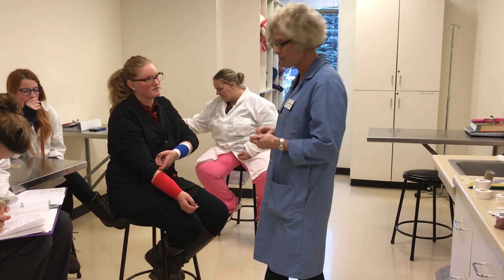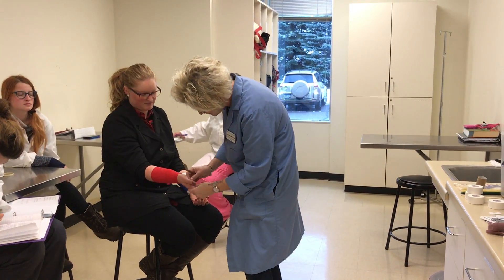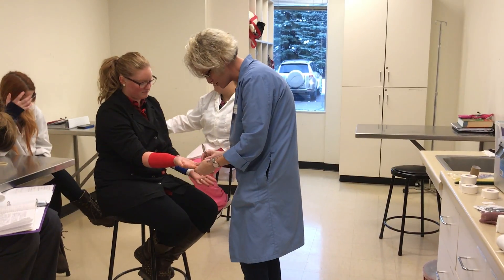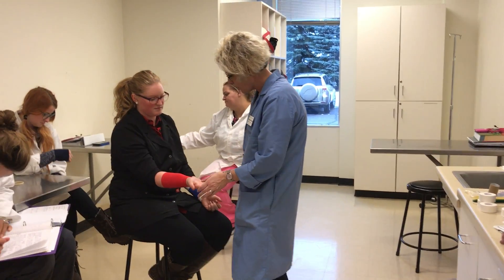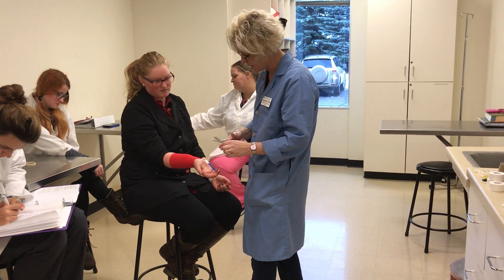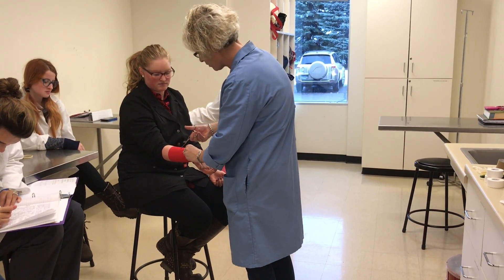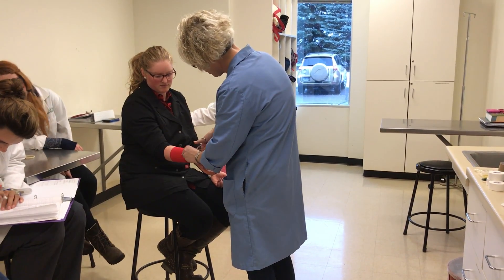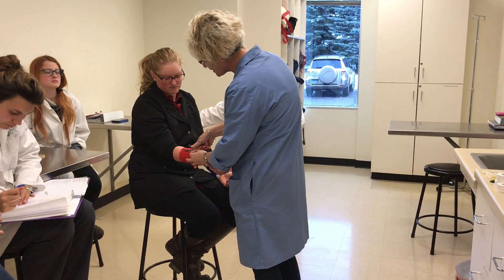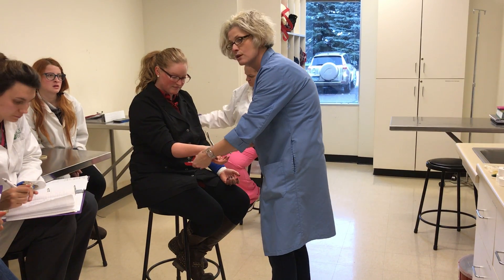This bandage will be kept on for about 24 hours post-surgically. I have my fingers on the digits — the phalanges — so I can assess if my bandage is too tight. When it's time to remove it, I'm going to take bandage scissors so it doesn't cut the animal, and away from the incision I'll work my way up or down the bandage — or you could take it off one layer at a time. Once it comes off, you can observe that incision.